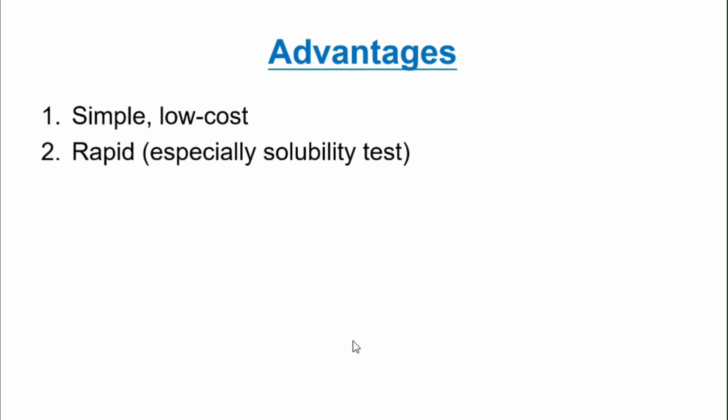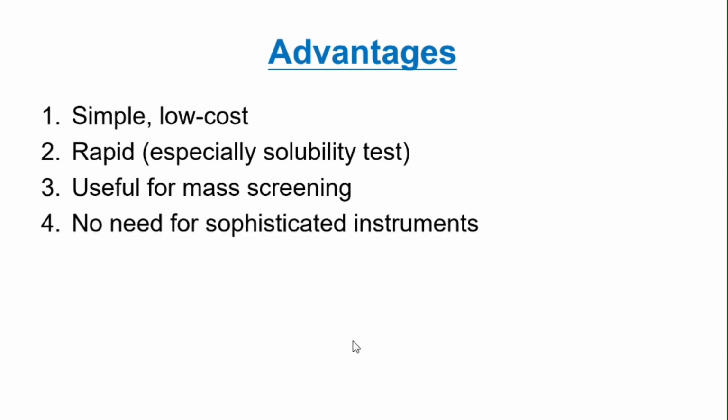Then we'll come to the advantages of the sickle cell test. Firstly, it is simple and low cost. Secondly, it is rapid, especially the solubility test. And thirdly, it is useful for mass screening. And fourthly, there is no need for sophisticated instruments.